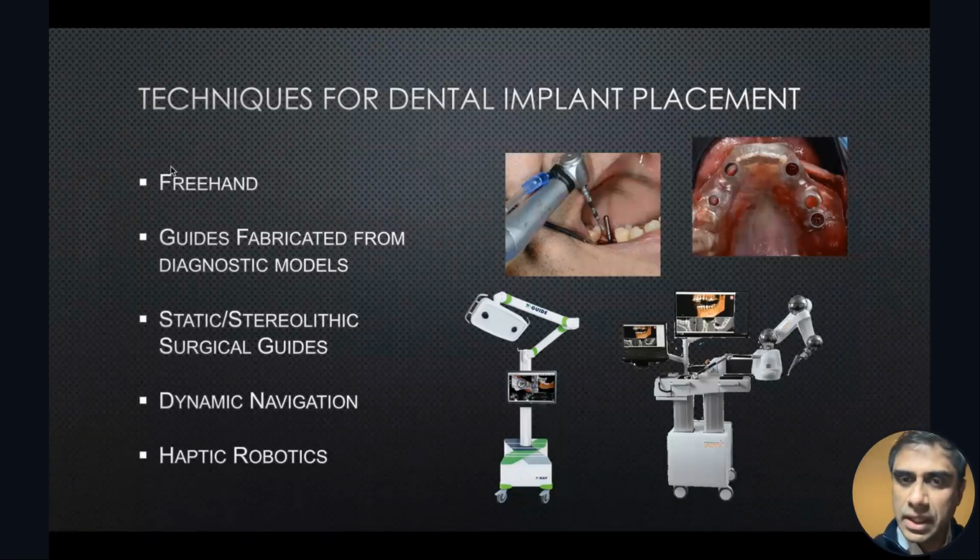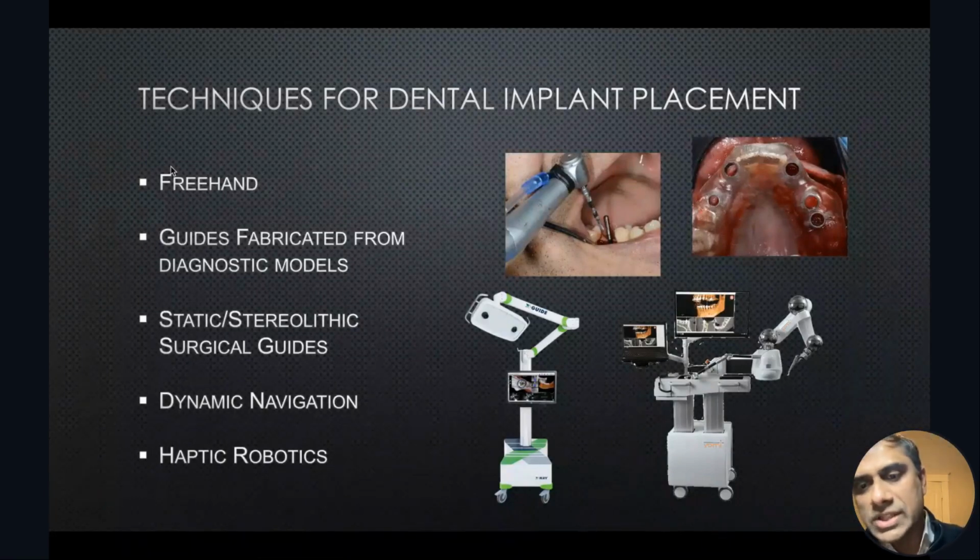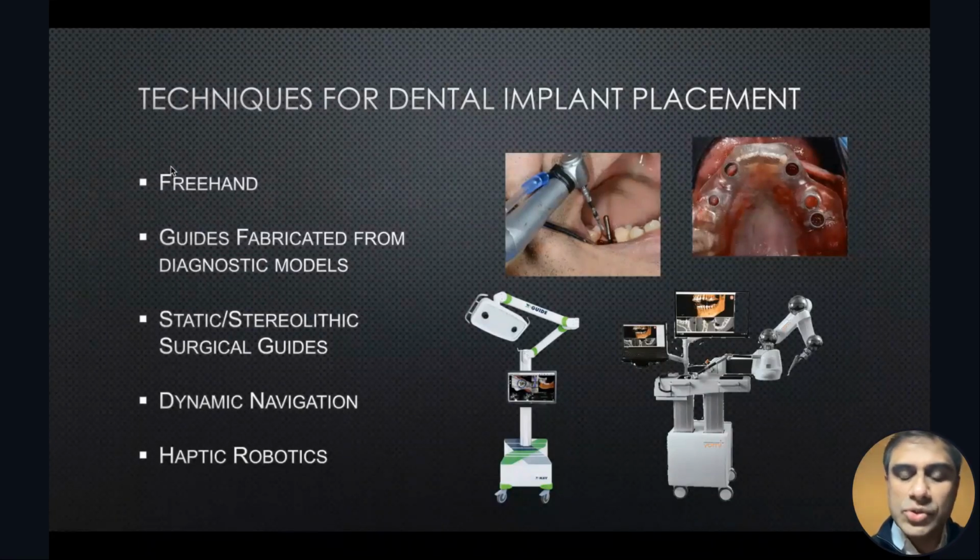And there are some videos along this presentation, and I'll bring your attention to certain audible sounds that really help you determine, and it gives you nice cues. And not only that, your staff members also give you feedback. Say you're placing an 11 millimeter implant, they tell you you're at 4, you're at 5, you're at 6. It's constant monitoring. All that monitoring is huge, as it creates a lot of security, and it makes sure that you're following the path, and there are no screw-ups.